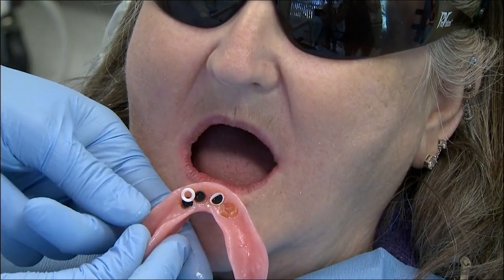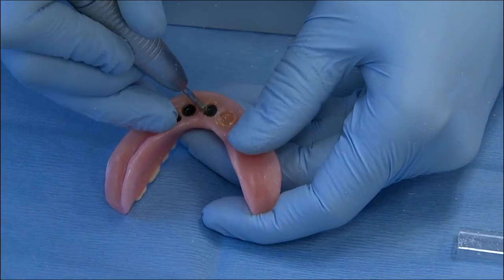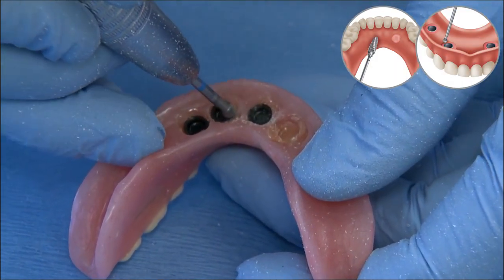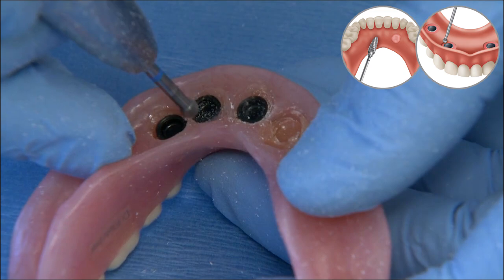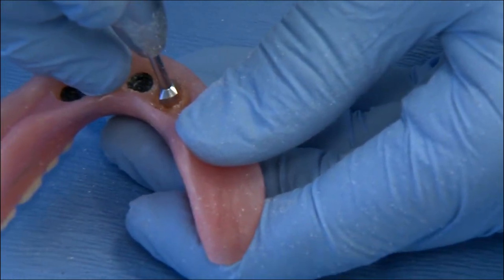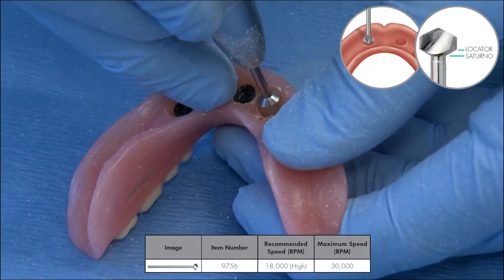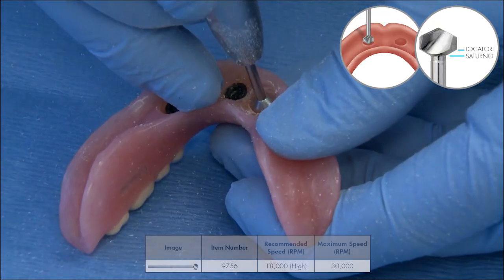It looks like I've missed the one on the left-hand side of the patient. The most likely reason is an excessive amount of saliva and not drying that denture cap. Thankfully, that type of missed pickup does not occur very often — it just happened here because of the training course. It gives us an opportunity to see some of the burrs in action, including the recessed burr, to remove that existing chairside material. Using the grind burr at high speed, I carefully trim away any excess chairside material. This can happen with any sort of live training. It gives us an opportunity to see the recessed burr being utilized to grind out existing chairside material — the same continuous motion works very easily to remove that material.